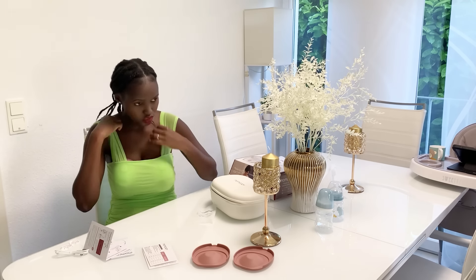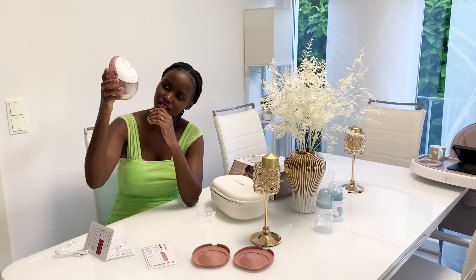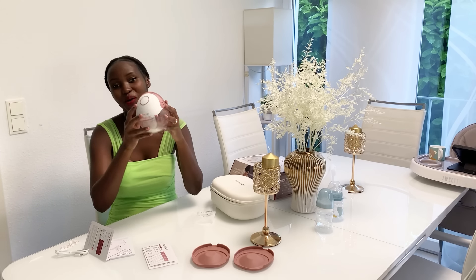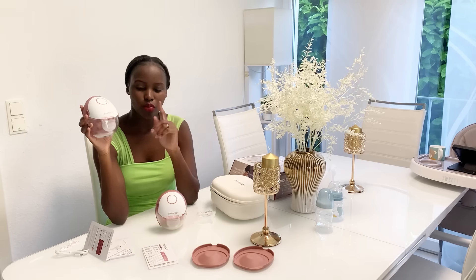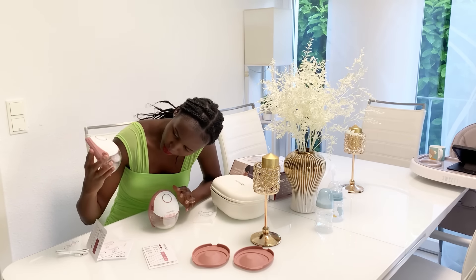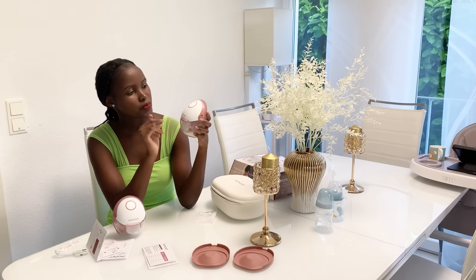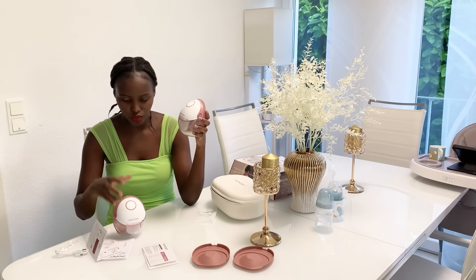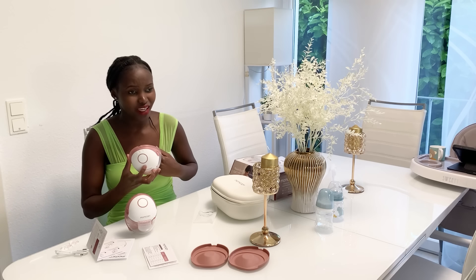I just paused to confirm that milk was pumping out — yay, it was pumping! Already pumped around 40 ml, wow. I had more milk on this side than the other, so maybe I just need to pump a little bit more and then feed Miguel. It's working and it's very easy to use — I just put it on, turned it on, and it started working. Miguel was sleeping but he just woke up so I'll pump a little bit more.